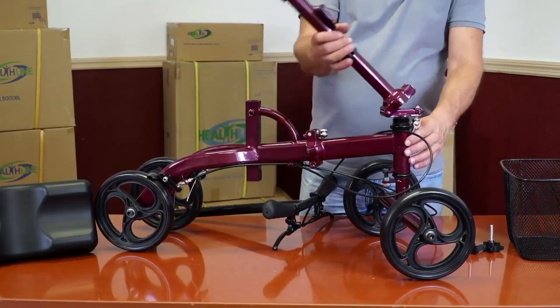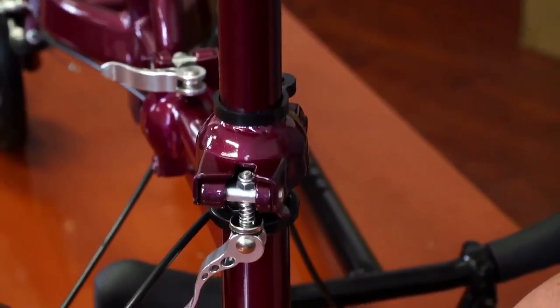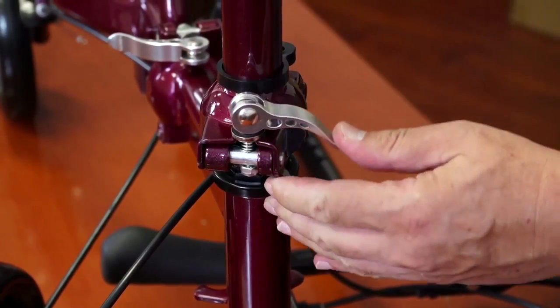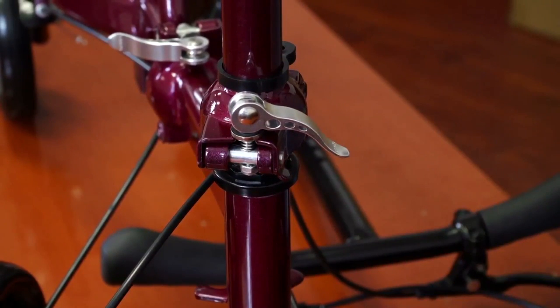Fold up the head tube and secure it with the spring-loaded locking mechanism by flipping it up and to the side as seen on the video. The head tube is now secured.